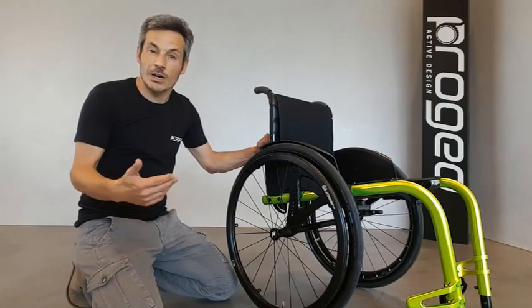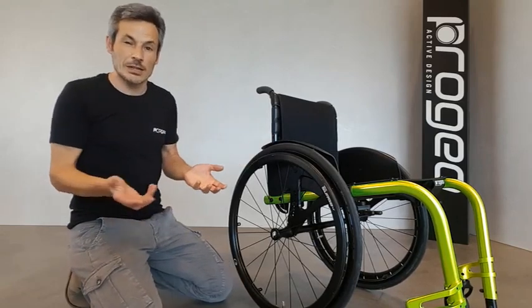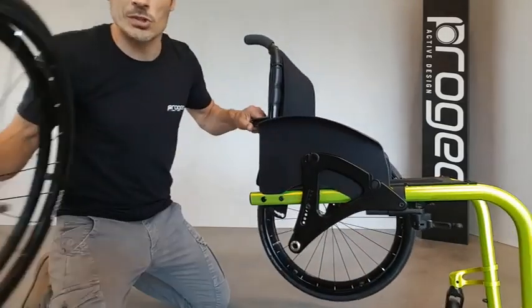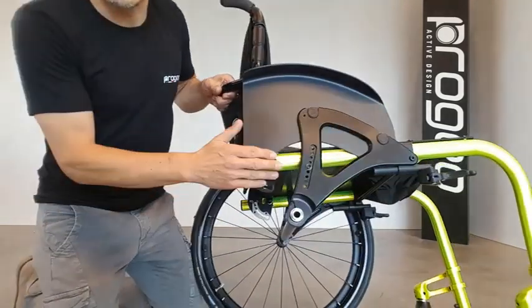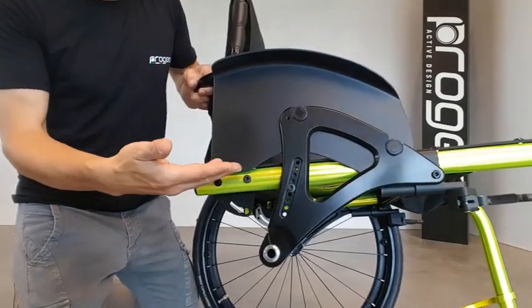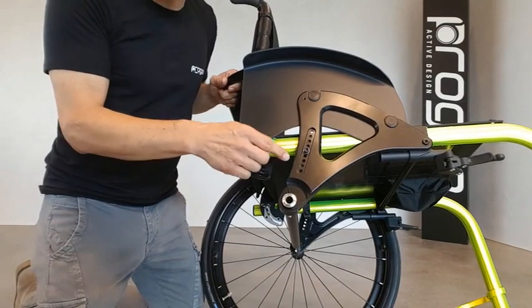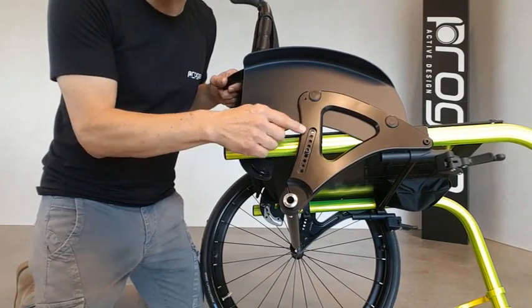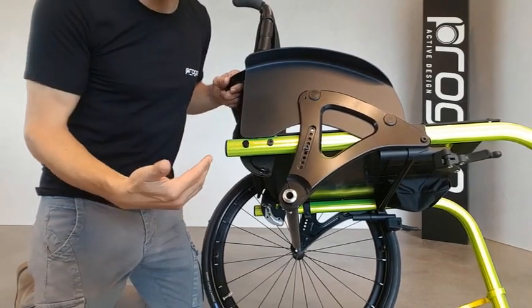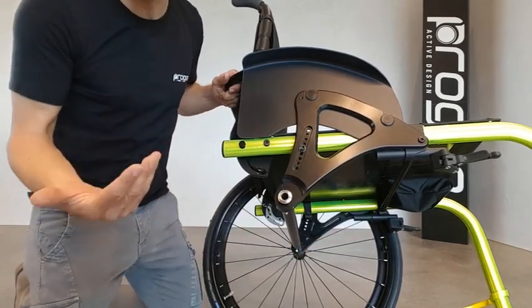We now learn about the heart of this wheelchair — in other words, the supporting structure of it, made of two side plates, one on each side, that connect the rear axle. This side plate allows for two very important adjustments: the rear height by means of these holes, and the point of balance by sliding the frame front or backward any millimeter.